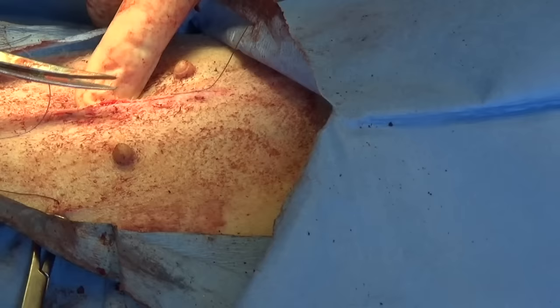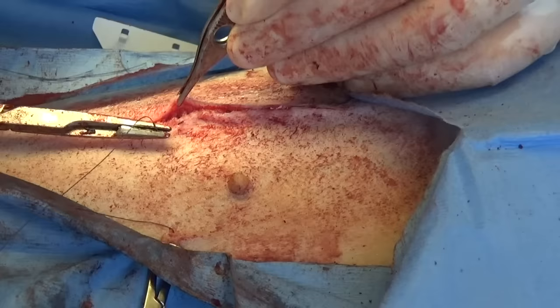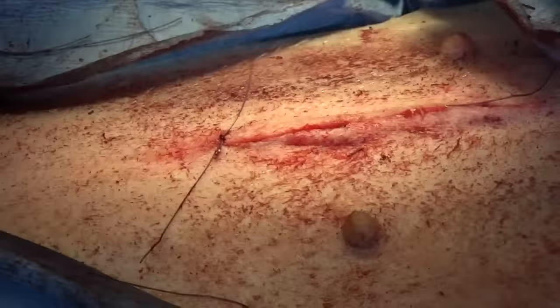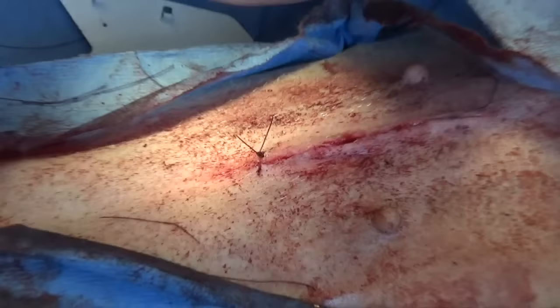Sometimes I won't put skin sutures in, but this dog's an active dog, so I'm gonna go ahead and put some skin sutures in so they go across the skin, not into the sub-Q. And then 1, 2, 3. And this one just laid across, barely, even looser than the muscle. Because the skin, you just need it to hold it together. You don't need any tightness because it's got all those other sutures. It's just a safety thing.